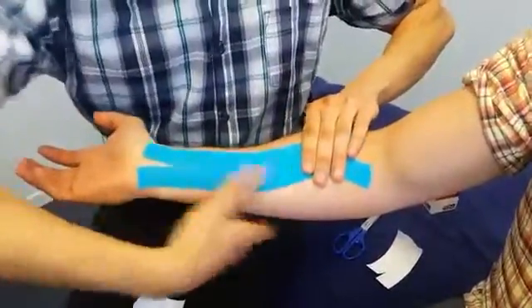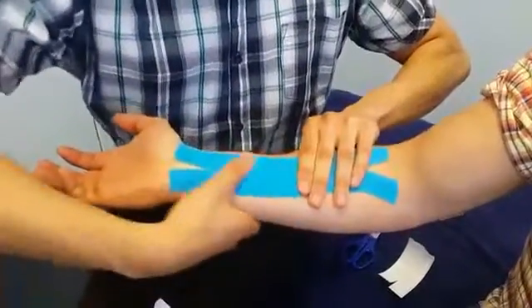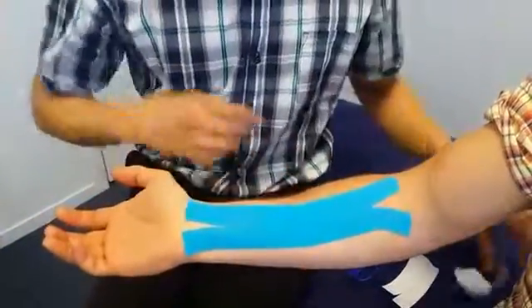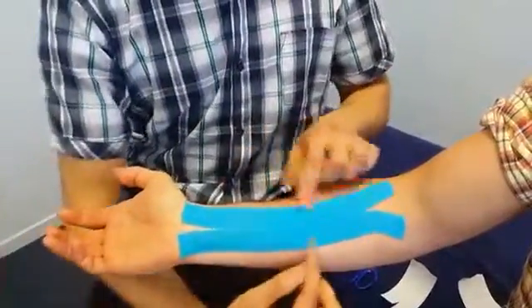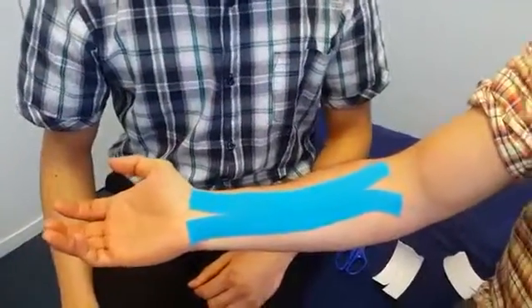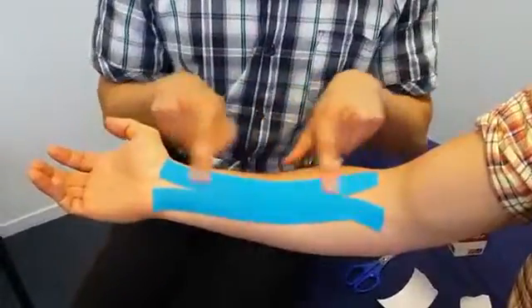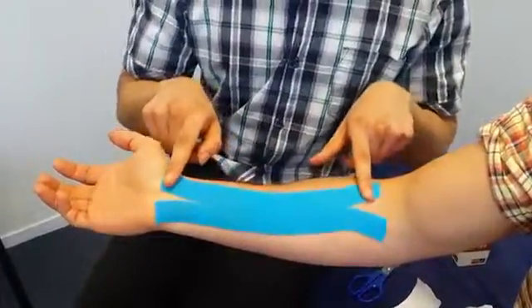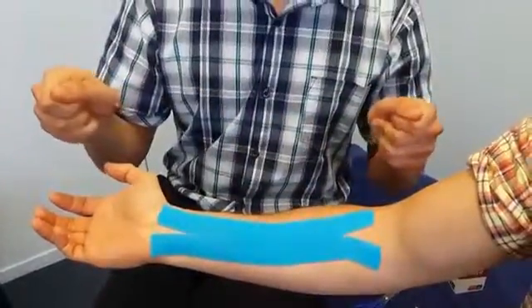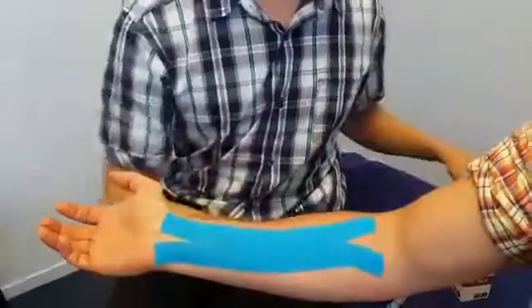Make sure you give it a bit of a rub down so the adhesiveness sticks to the skin. The reason for doing this is to move some of the tendons out of the way so the nerve can run through fairly easily without any compression. The last bit is to tape around the wrist itself. The amount of pressure you apply to this tape is about 25% — if 100% is the tape fully stretched, you want about a quarter of that.